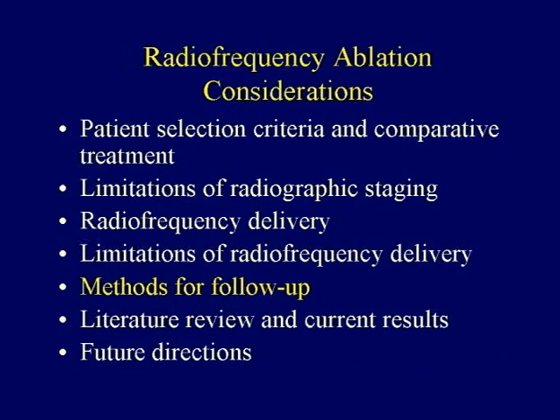A big issue has in fact been the follow-up of these lesions. Again, the problem in the lung is we're never quite sure whether we have achieved a good burn. We have an indirect sign of the ground glass halo. The second thing that we can do is try and see whether we destroyed the lesion, and conventionally as diagnostic radiologists we're all used to the concept of measuring lesions. Well, the catch here, as you'll see, is that nothing gets smaller after RF ablation. The lesion area appears to get bigger.